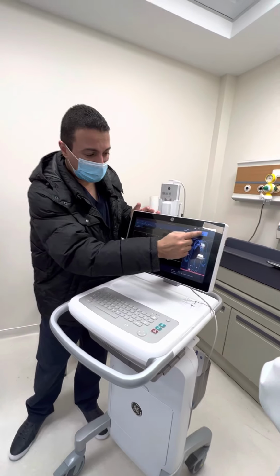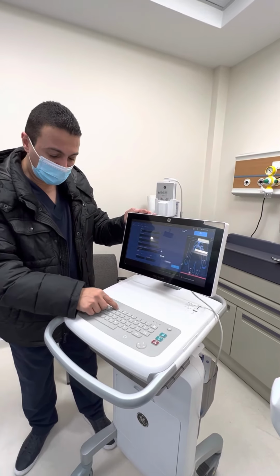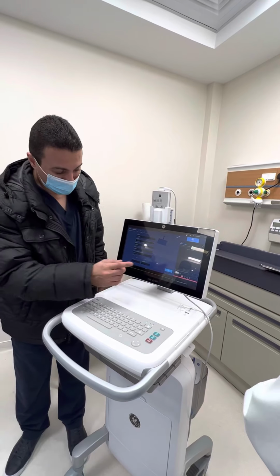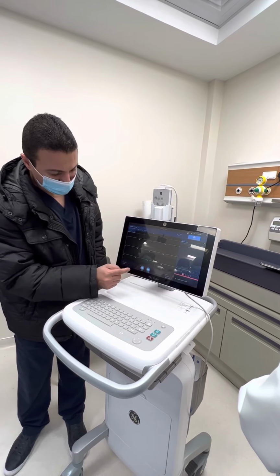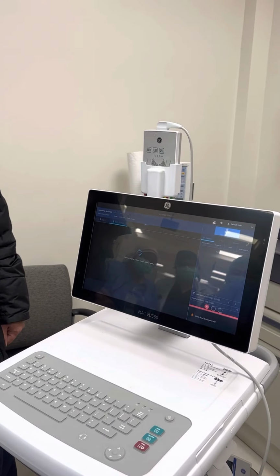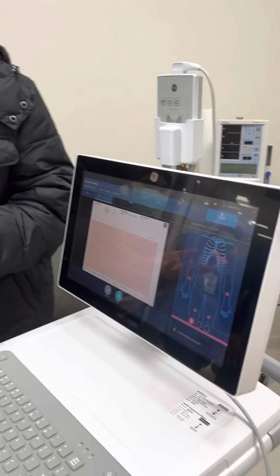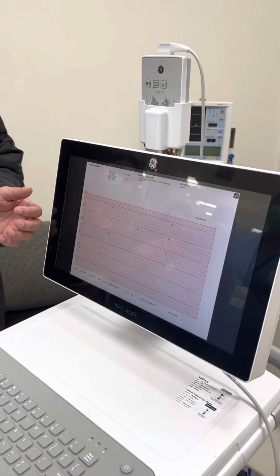So now let's imagine that we have this patient. Let me put 1, 2, 3, 4, 5, 6, 7, 8. Then I will do save. So this is my patient. You did acquire an ECG. Okay. So we said start ECG for my patient. So it will show up that way. So you have an ability actually to check the picture which you acquired. If it's not so clear to you, just expand, see it in a better picture.